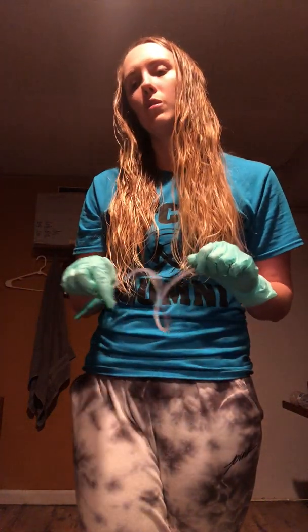So after we've gathered everything, I've already done this, but we're going to place the linen saver pad over the patient. We're going to put our gown on, our face shield, and our goggles on to protect ourselves. We're then going to turn on the wall suction or the portable suction machine, whichever you have.